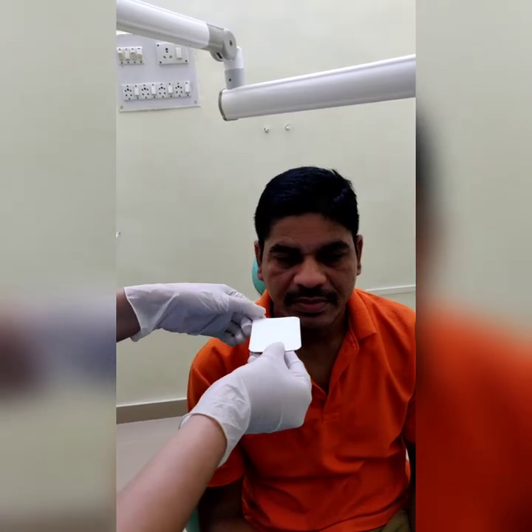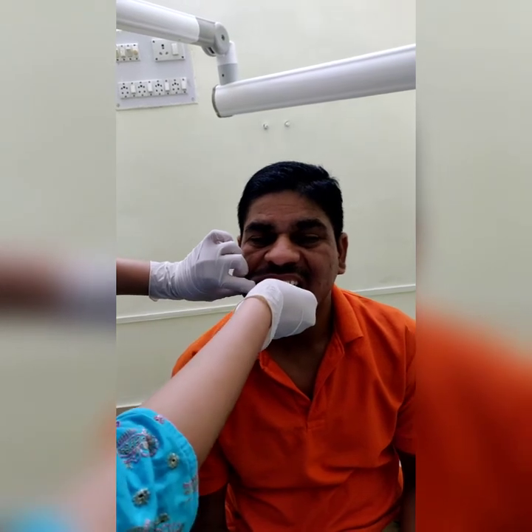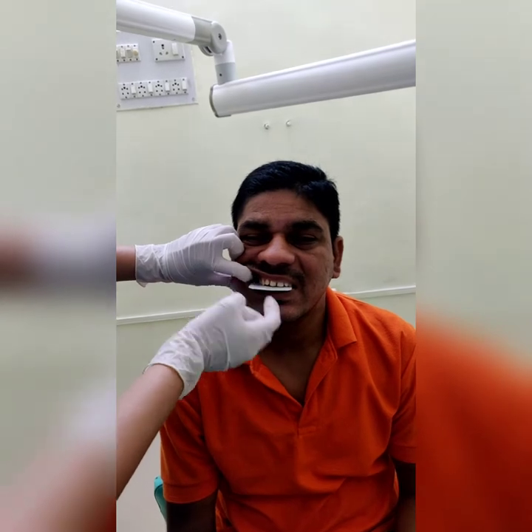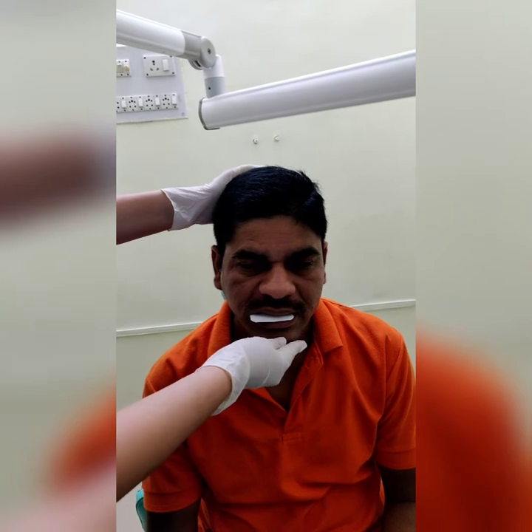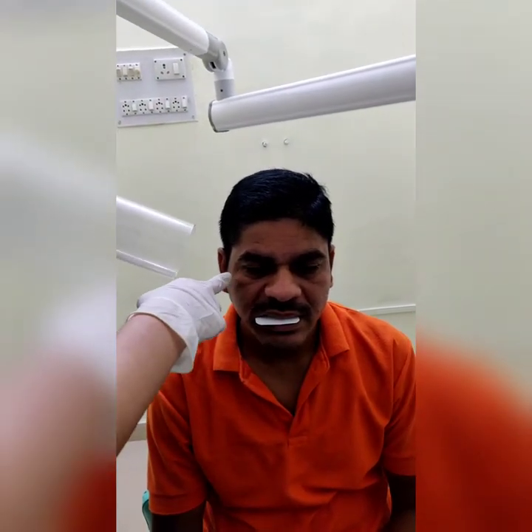During the lateral occlusal radiograph, the film is placed slightly lateral. The central ray is directed from the occlusal cusp. The patient's sagittal plane is perpendicular to the floor, and the central ray is directed 2 cm below the lateral canthus of the eye. The vertical angulation is plus 60 degrees.